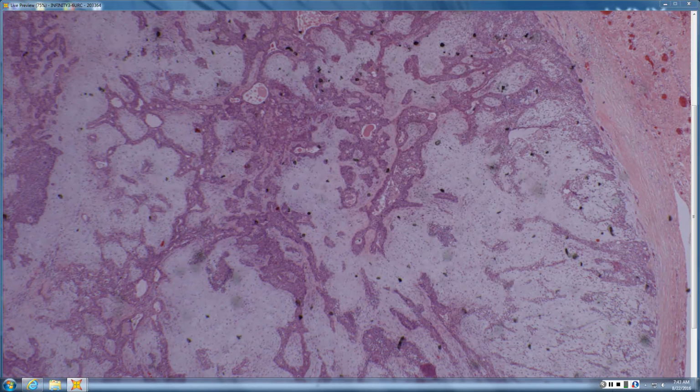It is also called chondroid syringoma. Either name is fine. This is the more common type, which is the branching alveolar type. Branching and alveolar ducts that surround areas of stroma, often with a blue myxoid hue. So kind of a gray-blue myxoid hue, and there are anastomosing strands of epithelium surrounding areas of stroma. Kind of the opposite of a mucinous carcinoma, where it's the mucins surrounding the little blue islands. Here it is definitely anastomosing strands that surround and trap areas of myxoid stroma.